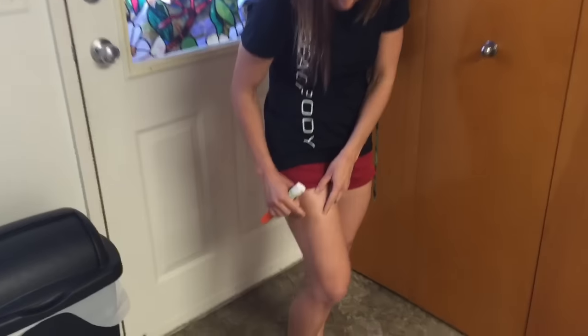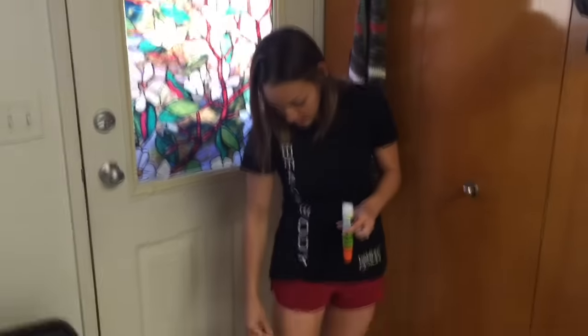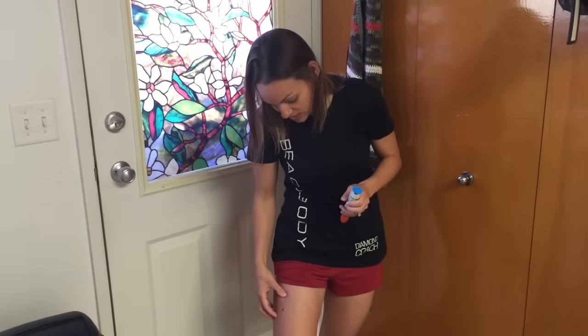You can see where I put it in. I didn't feel the needle. I can feel the medicine kind of flowing a little bit now. My husband said he felt it a little bit more a couple minutes afterwards, but I know it starts working right away. These are EpiPen juniors, so they're obviously not meant for our height and body weight — that might be why we're not feeling it as much right away. For me it feels a little bit tight on my leg, almost like I just got pinched or a little sting. But that's about the most it feels.